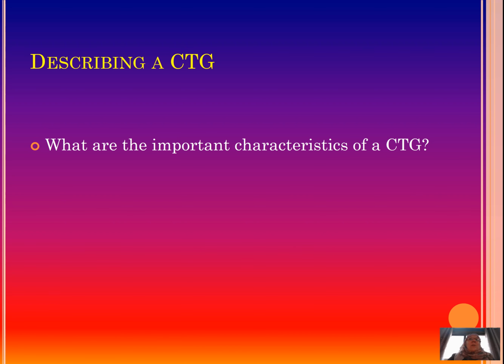So let us look at describing a CTG. This is what we want to achieve during this lecture, that you are able to describe a CTG. What are the important characteristics of a CTG? Just write them down.